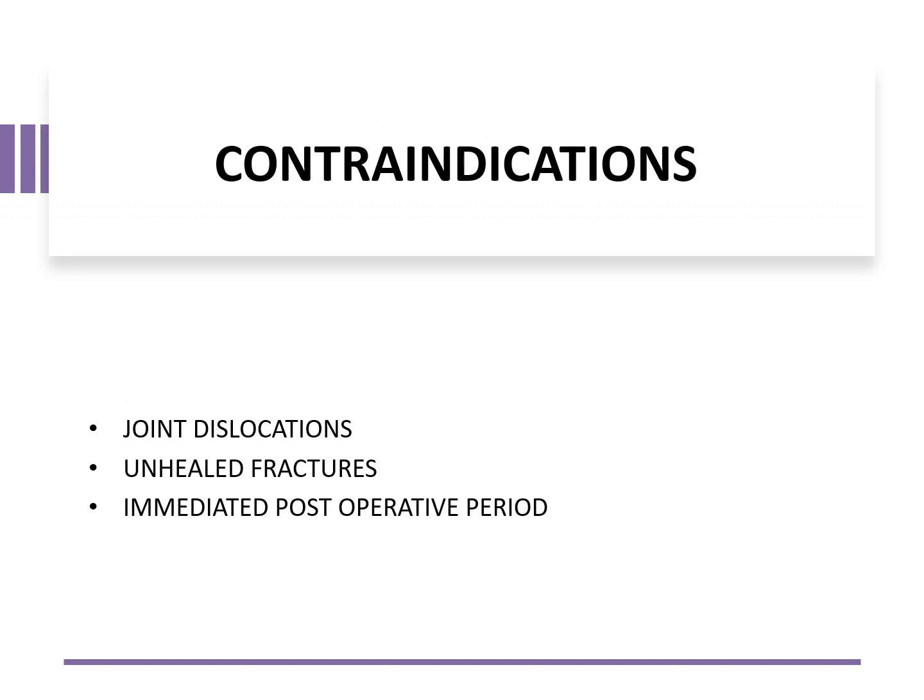Now coming to contraindications, where you should avoid goniometry. You should not do goniometry, you should not assess range of motion in certain conditions like joint dislocations. If the joint is dislocated, you're not supposed to move it. You're not supposed to do passive or active range of motion because the joint is dislocated. You will cause much harm and pain to the patient, so you're not supposed to do it. This contraindication means you're not supposed to do it.